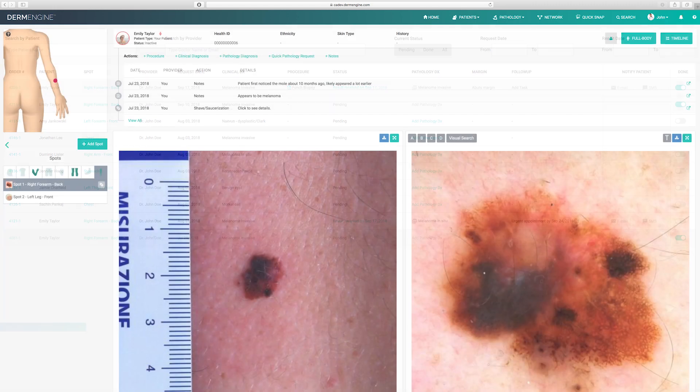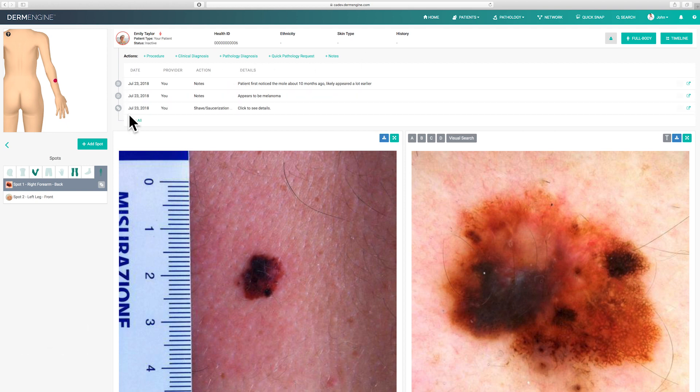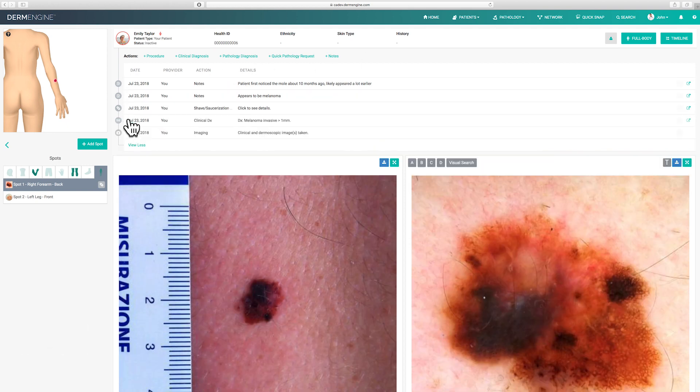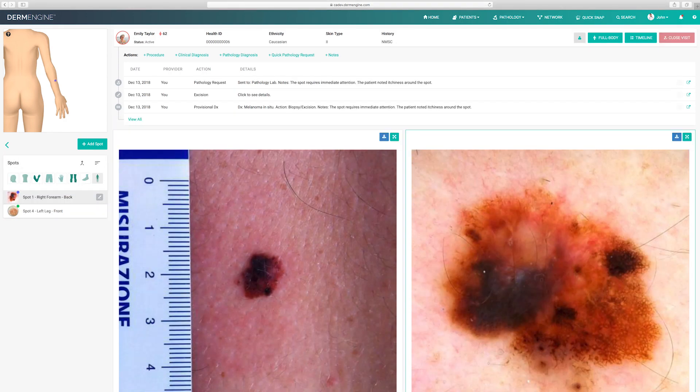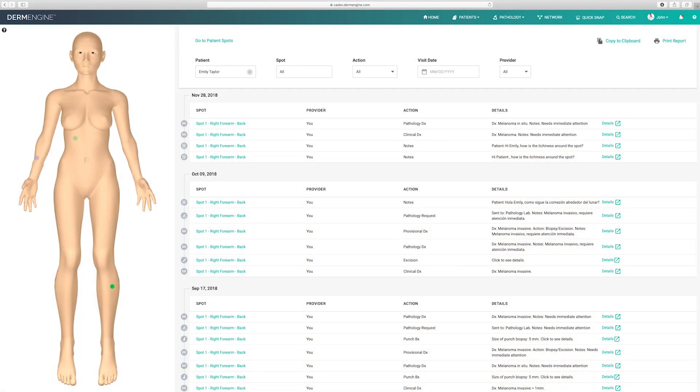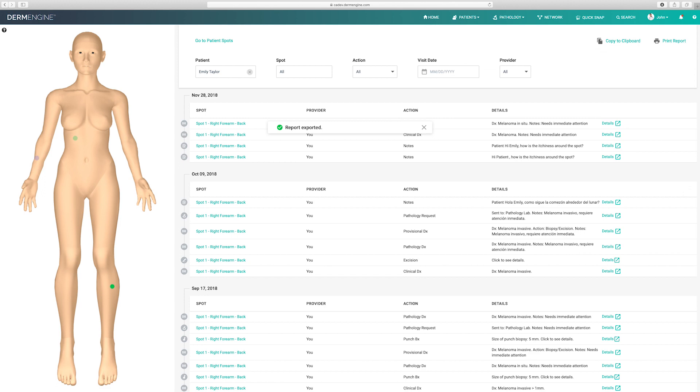Next is the timeline. DermEngine's timeline keeps record of all actions and notes you've made for each spot. On the top right side, click timeline to view it in more detail. You can see all actions performed on specific spots or patients and create customized PDF reports. If your patient management system is integrated with DermEngine, you can click export to directly sync the systems together.